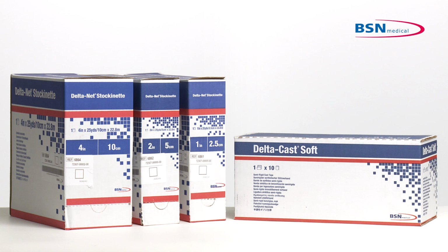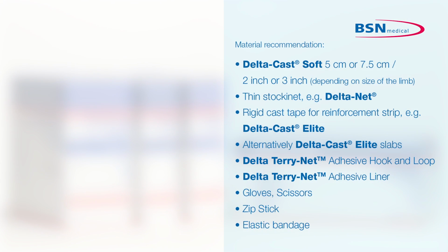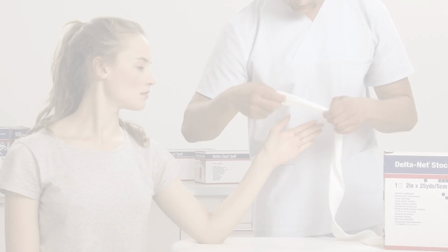Define position of limb before start of application. Thumb and index finger opposing, wrist in slight dorsal flexion and neutral ulnar radial deviation. Due to the semi-rigid properties of the Delta-Cast Soft, only minimal padding with a thin stockinette is required.